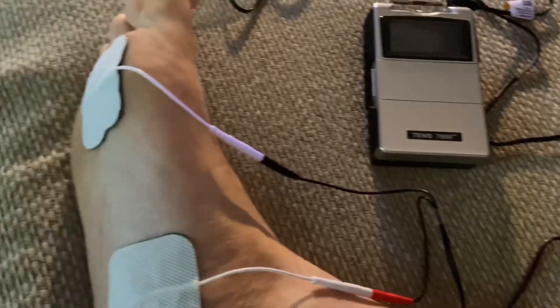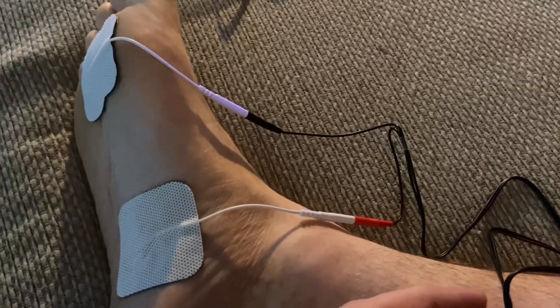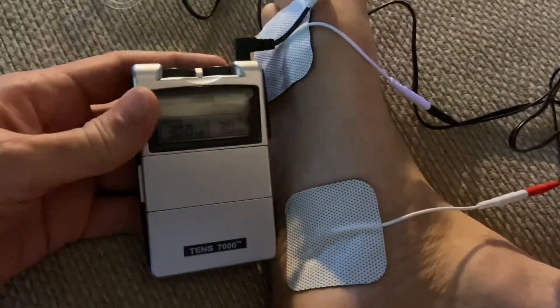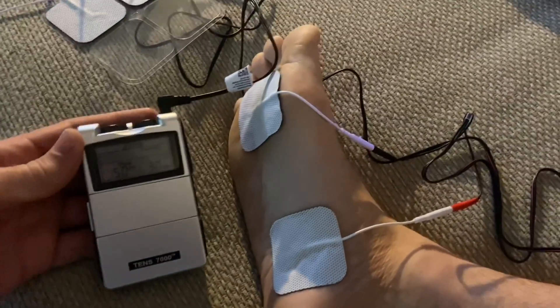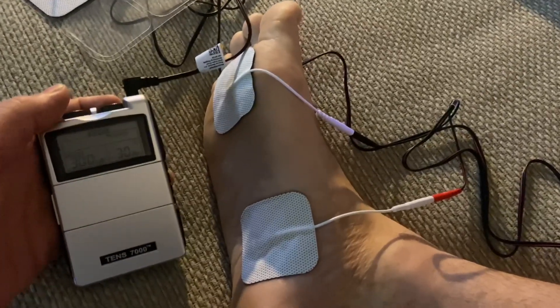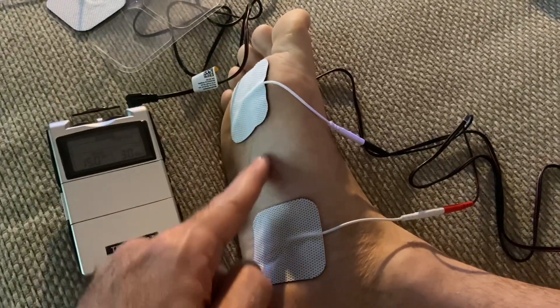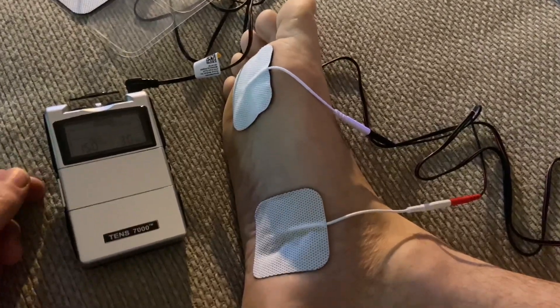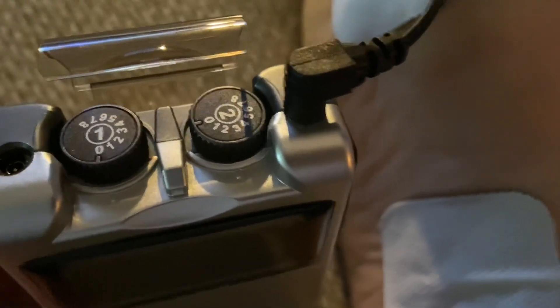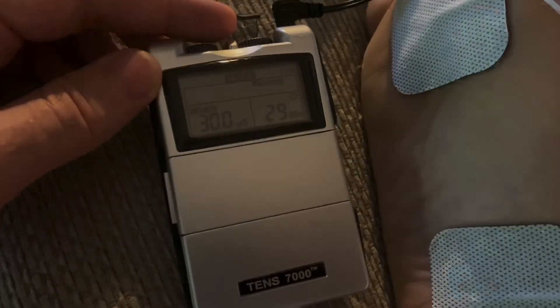I'm going to try this again. This is a lot stronger than the one I used before. Let's see if you can see what it's going up to and how this thing responds — I am barely going to move it. I can feel it just barely tingling between the two. I have it set to between two and three, and that's at 150 hertz. Okay, so that's normal.